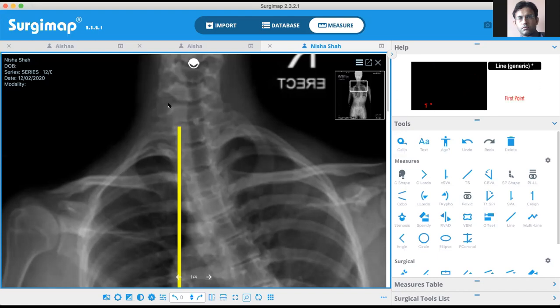Ideally what you need to do is draw upper and lower lines parallel, then take the center point of them and connect them. Similarly, you draw parallel lines vertically on the right as well as left side, take their center point and connect them. The intersection of these middle lines will be the centroid of any body, or for that matter, a disc. Now here we tried to do it yesterday, and it was requiring lots and lots of steps, at least 10-15 steps just to find the centroid.